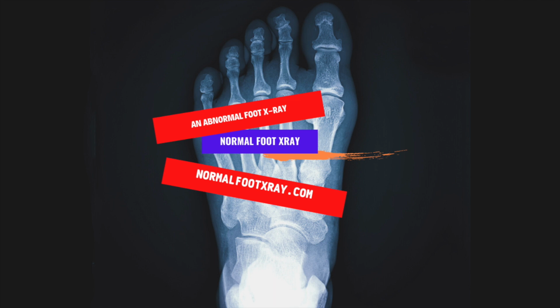Using small doses of high-energy electromagnetic radiation to produce an image of the inside of the body, foot X-rays are safe for adults. They are not recommended for developing fetuses, so women should let their doctor know if they are expecting. It is important to note that a foot X-ray passes through the soft tissue of the foot, not through metal or bone. Different types of tissues absorb different amounts of radiation, resulting in various shades of black and white.